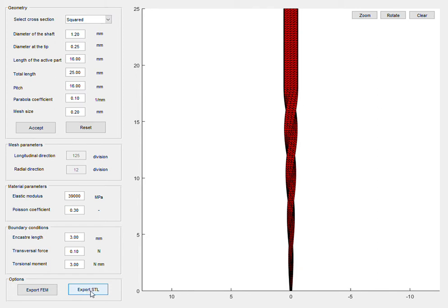any CAD software. And if we export for a finite element model, we will need to define the elastic parameters of the material, which include the elastic modulus and the Poisson coefficient, and also the loading and boundary conditions for the finite element model, that include the length of the encastre in millimeters and also the transversal force and the torsional moment that are applied at the tip of the tool.